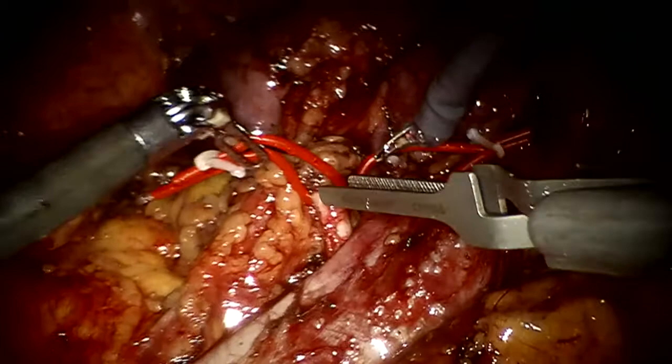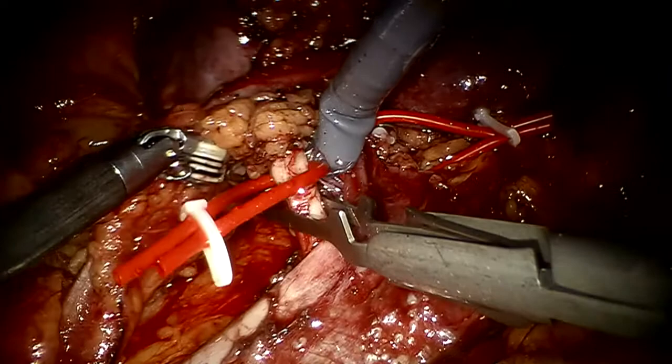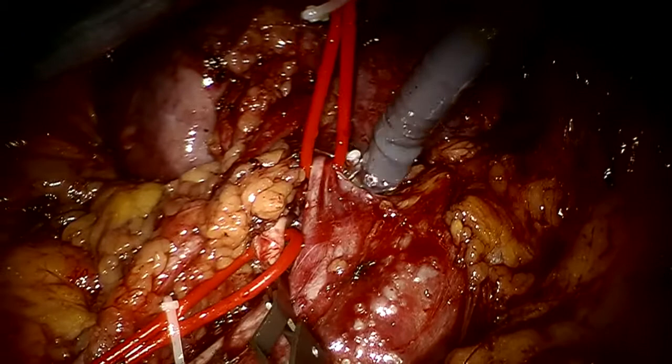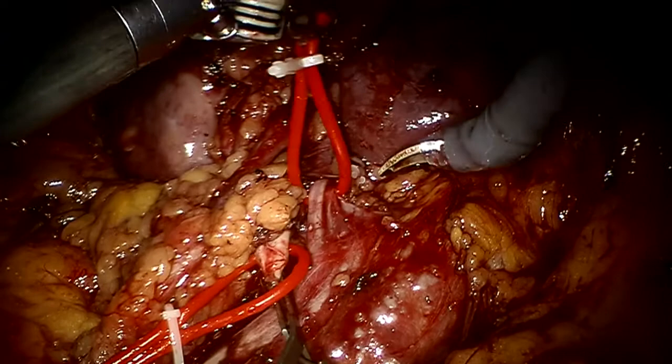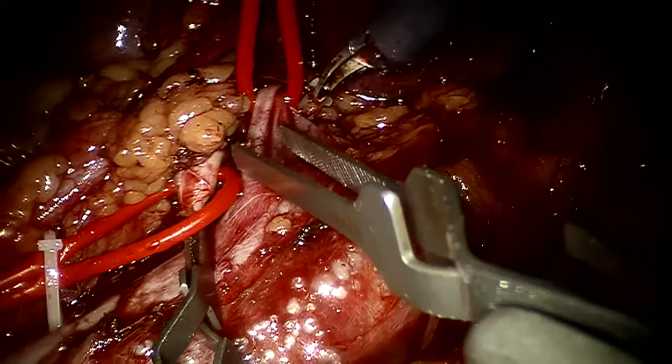So okay, great. You don't have the robotic? No. Okay, fine. Open more. Beautiful. Hang on. Hit it. Perfect. Excellent. One more, please. Okay, somebody can note the ischemia time now. What's the time, guys? 10:11, okay. The renal vein bulldog is optional, but not a bad idea in this one. Would you do also a clamping on the left side renal vein? And that's it.